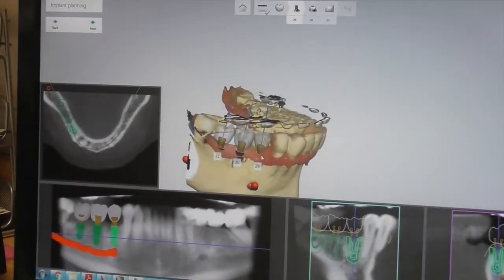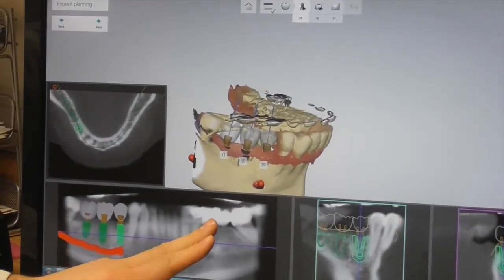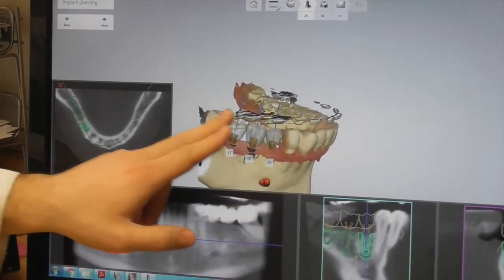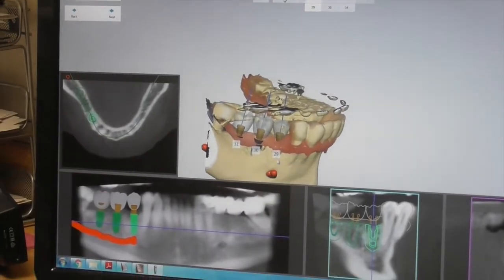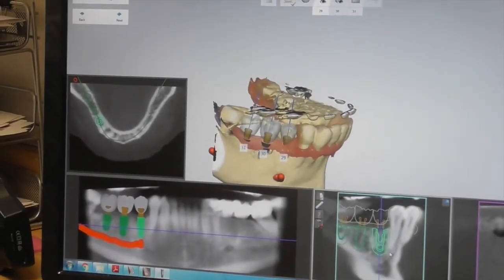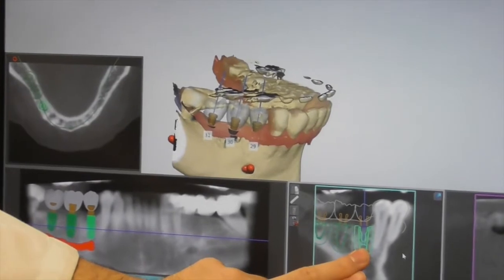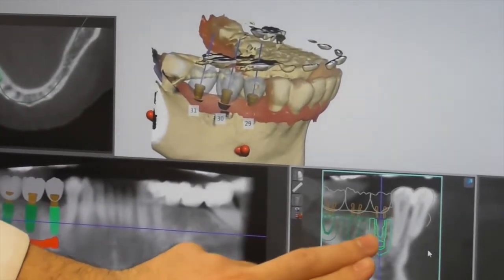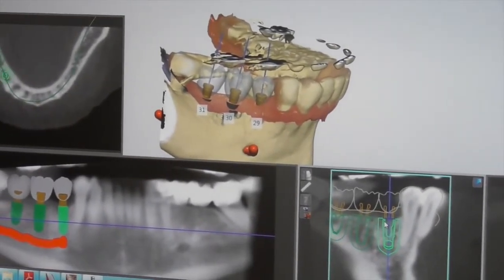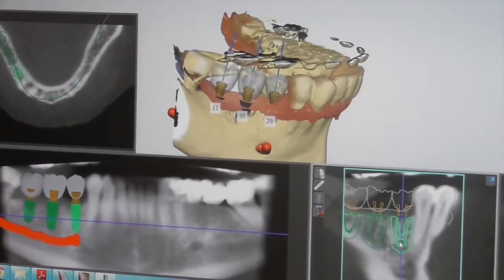The next step is to place the implants using the CT scan with the intraoral scan right on top of the bone. So now we have a situation where I can place the implants, design the crowns, and make a surgical guide so that we can precisely place the implants based off of the planning.